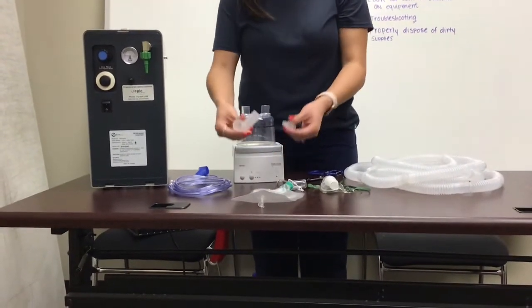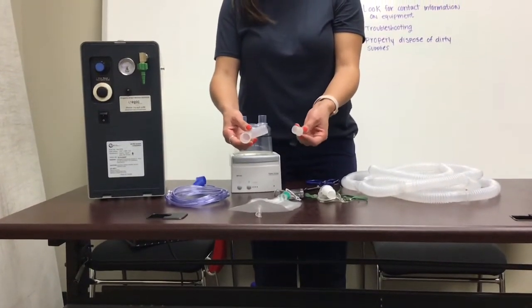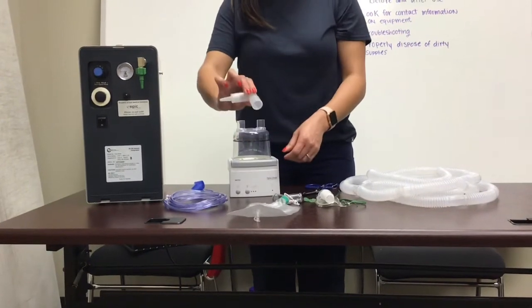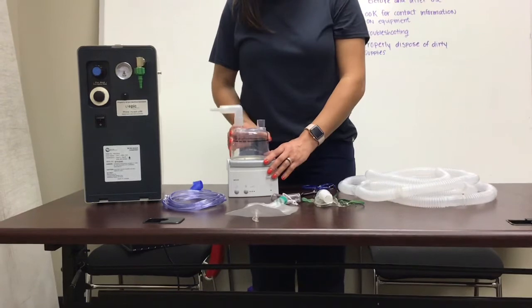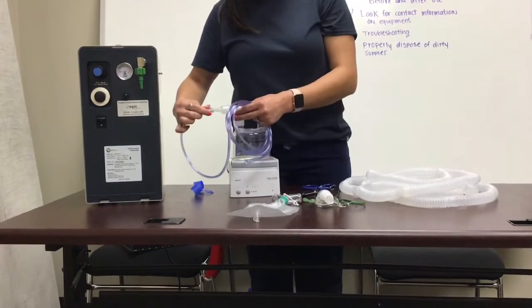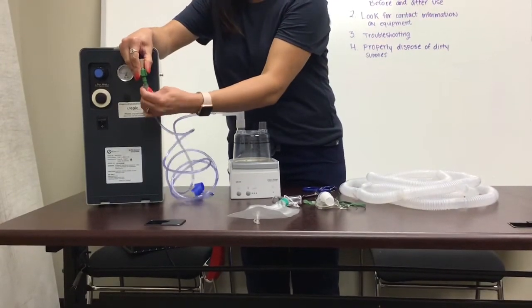Next, you will need to connect your elbow adapter and your concha adapter. When connecting this, you want to make sure to connect your concha adapter to the smaller end of your elbow adapter, making sure it is tight and secure. You will then place the larger part of your elbow adapter to the top port of your water chamber. You will then grab your 7-foot tubing that will also be provided to you. One end will be connected to your concha adapter, and the other end will be connected to the compressor on the Christmas tree.